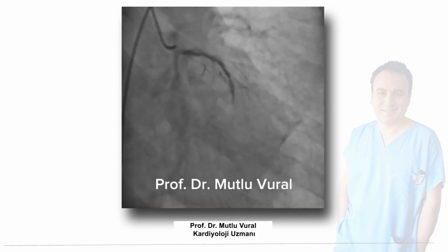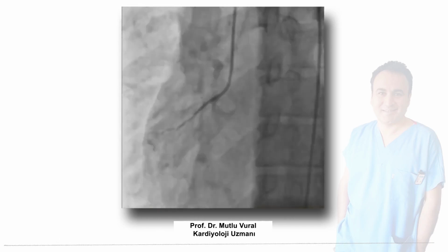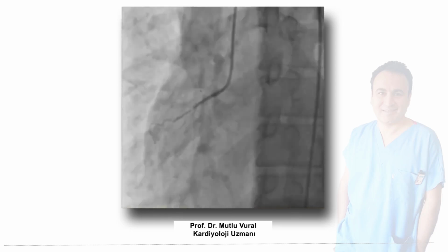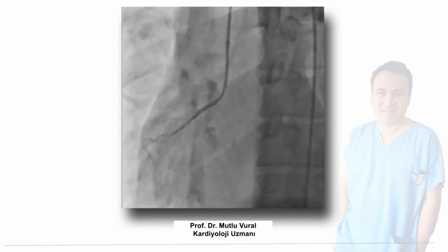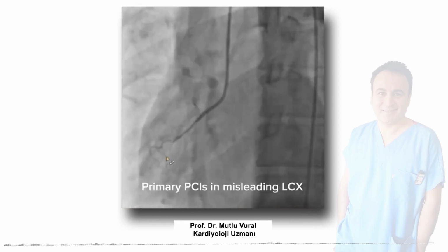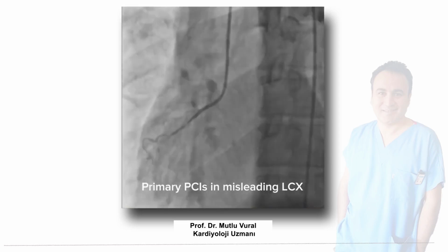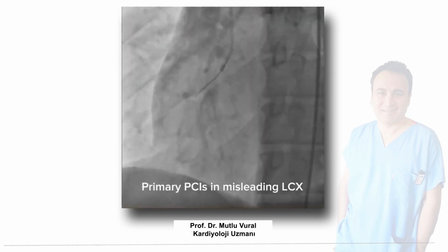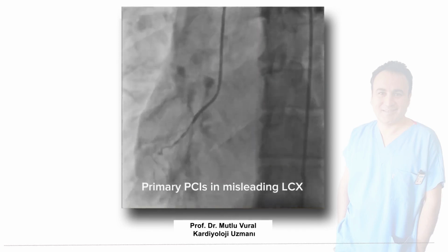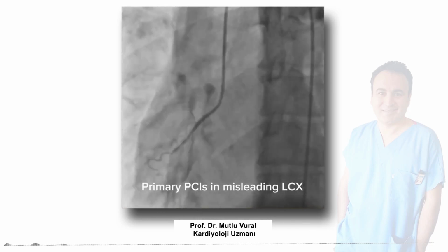Echocardiography showed inferior hypokinesia, and this is total occlusion of the RCA. We first tried to perform reperfusion in the RCA. This is an AR1 guiding catheter. When it was difficult, we used a hydrophilic guide wire.